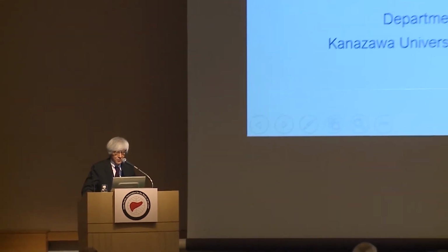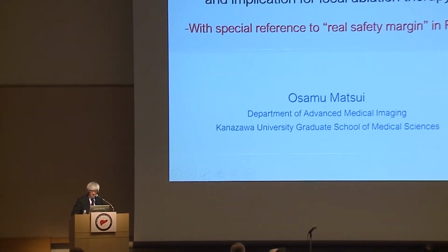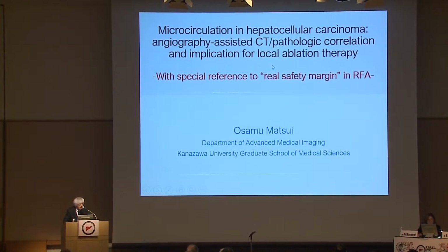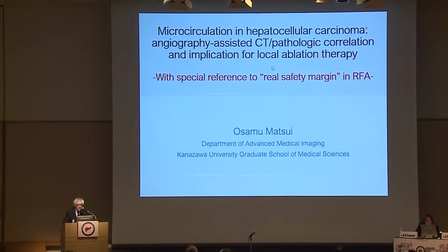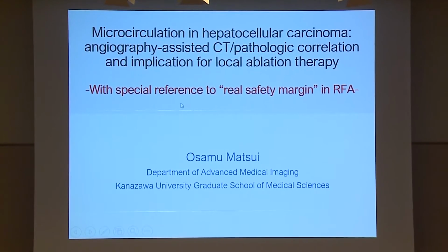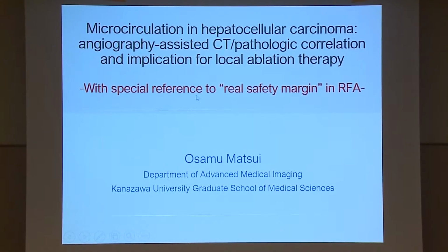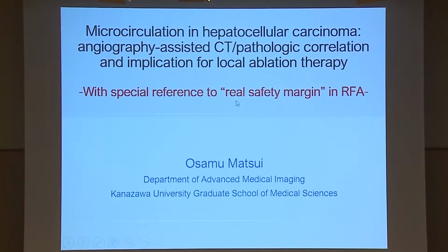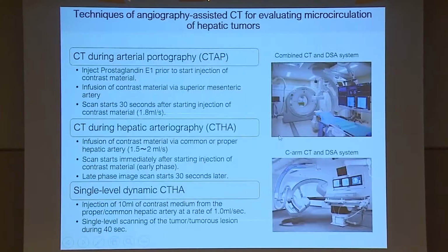My title is Microcirculation in hepatocarcinoma, angiography-assisted CT pathological correlation and implication for local ablation therapy. Because this session is for radiofrequency ablation, I would like to focus my talk on the real safety margin in RFA from the pure point of view of microcirculation.